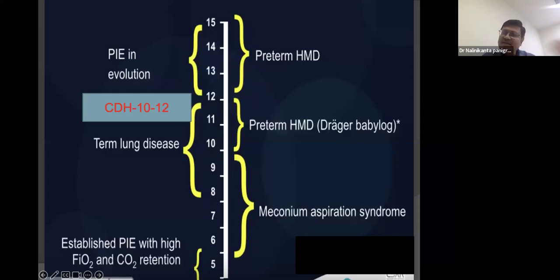With a higher frequency, there is lesser carbon dioxide washout, and you will get less incidence of hypocarbia. But coming to term lung disease, meconium aspiration, congenital pneumonia, PPHN, frequency 8 to 12 is ideal. Start with the middle, 10. Depending on the need, you can go to 12 or come down to 8.